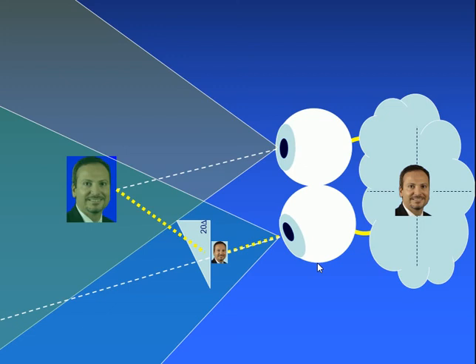This is not only helpful in terms of making the diagnosis and the assessment, but it can also be very helpful in terms of treatment. So for example, if I wanted to help this person with glasses, I could ask an optician to prepare glasses for the patient that have 20 prism diopters in it, and when the patient puts those glasses on, they should see single. So prisms are not only helpful, again, for assessing the patient, but they can be very helpful in terms of actually treating patients as well. And we'll discuss that a little bit more in the section of the lecture that deals with treatment.